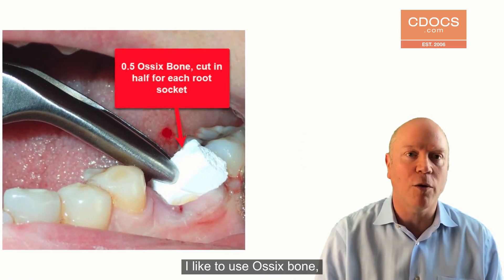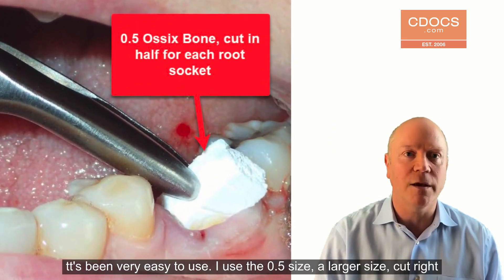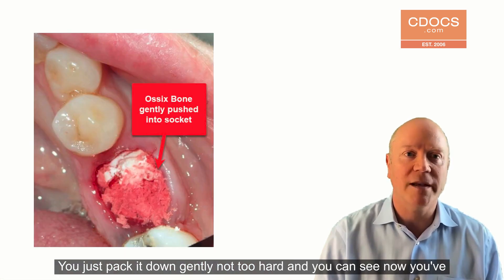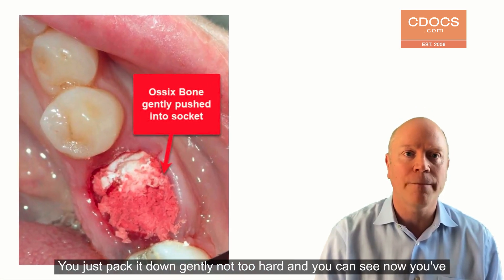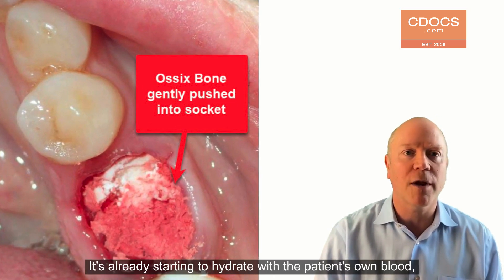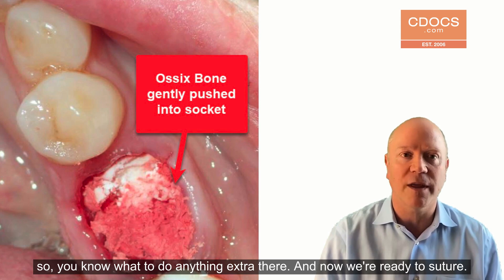I like to use Ossix bone — it's been very easy to use. I use the 0.5 size, the larger size. Cut it right in half, put a half into each root socket. Works great. You just pack it down gently, not too hard. And you can see now that you've got it compacted in there, it's already starting to hydrate with the patient's own blood, so you don't have to do anything extra there.